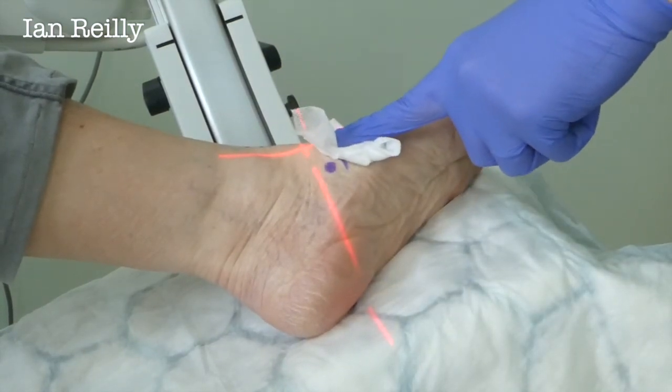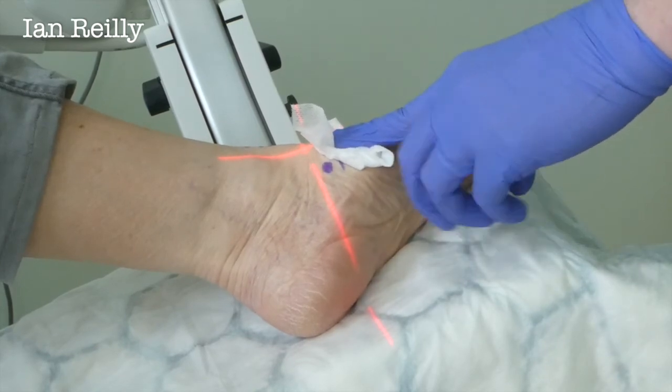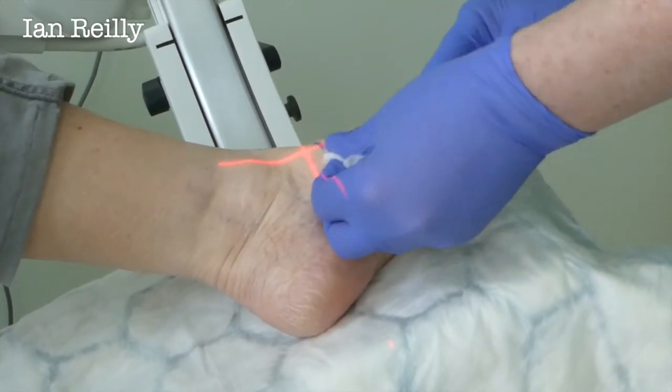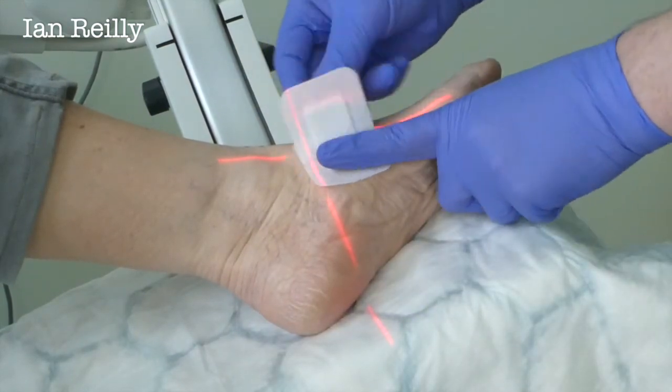So on one view it looked like we were missing the joint, but when you look on the other view it shows you it's right in. This is the benefit of having x-rays, because you don't know without an x-ray quite where you are.